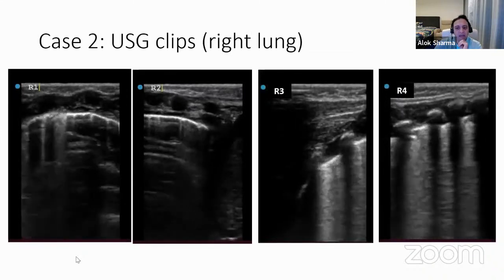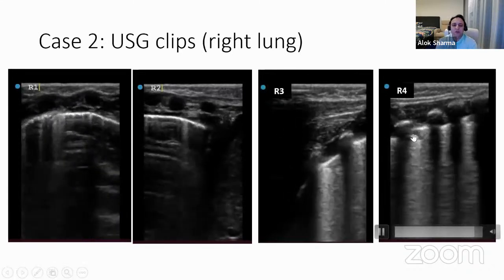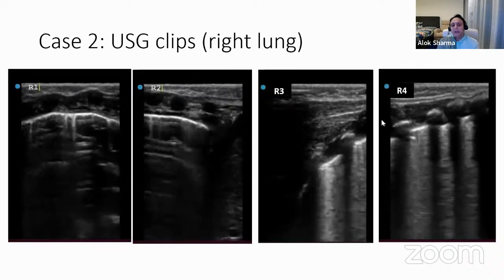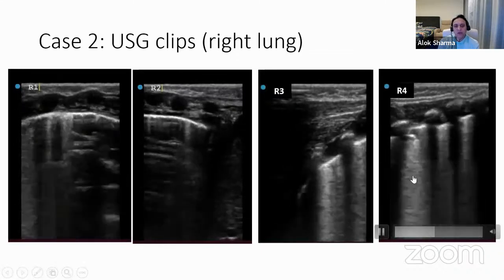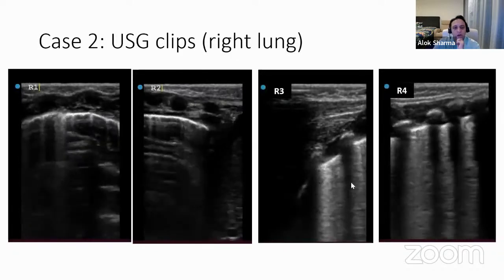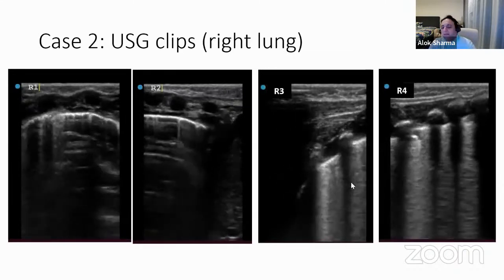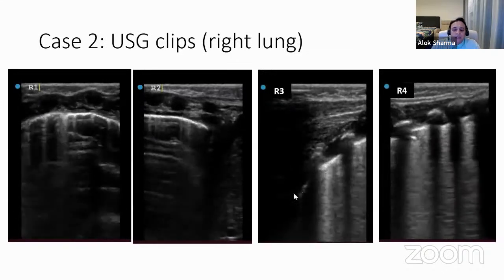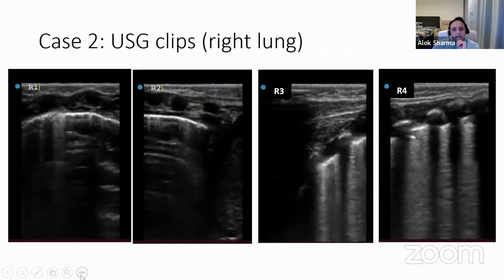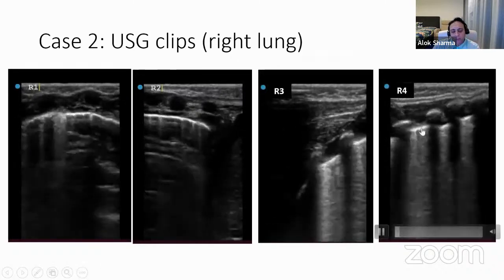And that might also be the reason why in R4 you see that subpleural consolidation, because your argument would be, well, this is a baby who shouldn't have RDS. But when you look at R3 and R4, what you're seeing is a baby with delayed perinatal adaptation, where the transition of the lung fluid is taking more time because the baby's had therapeutic hypothermia and has fluid retention, possibly an element of surfactant inactivation, but gravity-dependent accumulation of fluid, which means that the R3 and R4 regions are B-profile dominant. Now, what is very important, and this is one thing I'd like to highlight, I'm spending a little bit more time on the review, is if you look at R3 and R4, the pleural line is regular throughout. Can you see that? Mm-hmm. It's regular throughout. Now, can we go back to your previous slide, please?